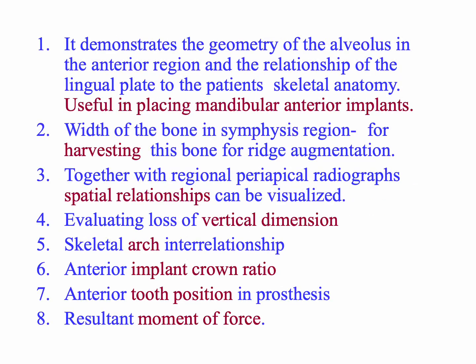Lateral cephalometrics are used while placing mandibular anterior implants or when we need to harvest bone for ridge augmentation in the symphysis region. It can also be used when you need to find out a spatial relationship in the localized region. It can also be used for evaluating loss of vertical dimension. Skeletal arch interrelationship can be found out. Anterior implant crown ratio can be determined. Anterior tooth position in the prosthesis can be determined.